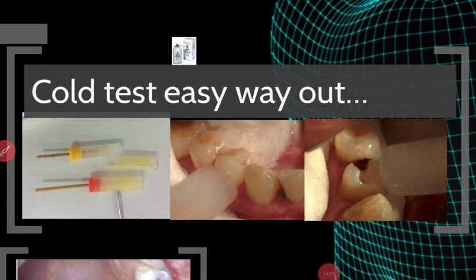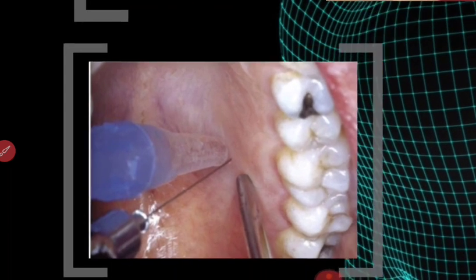I don't advise this, though I designed this as a simple innovation. Took a guttapercha tube, drilled a hole in it, put half a toothpick in it, and then we used to do the cold test in our institute. So now we have stopped it because the water used to flow on other teeth. You have to isolate them, otherwise you will get a false positive. So Endo-Ice is recommended. This is simply something we designed, and now we don't follow it anymore.